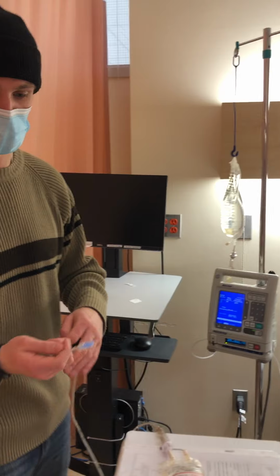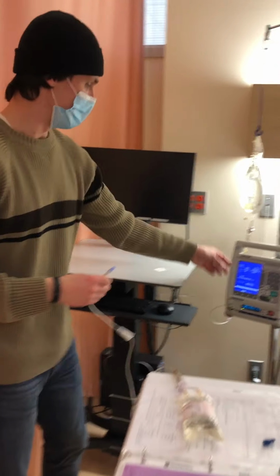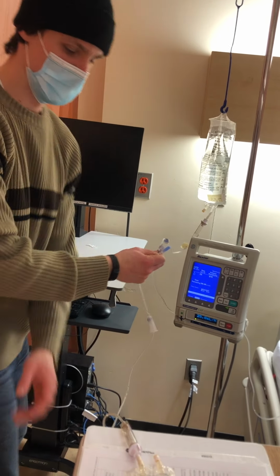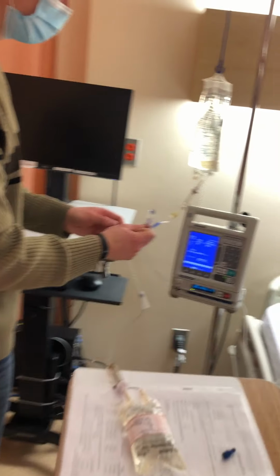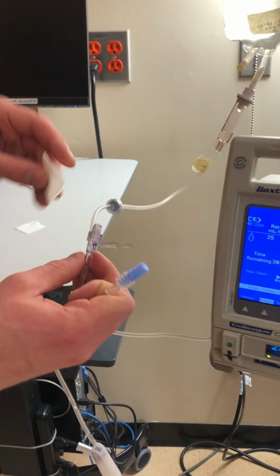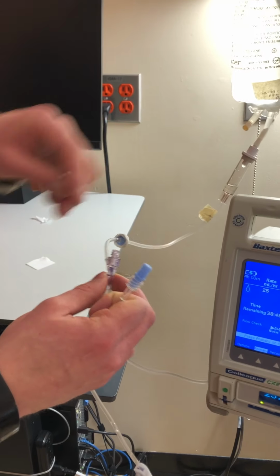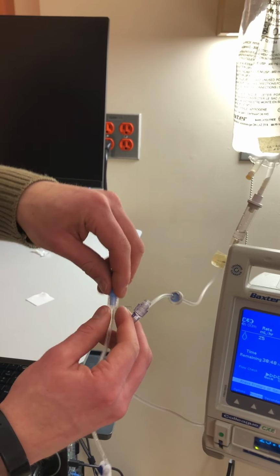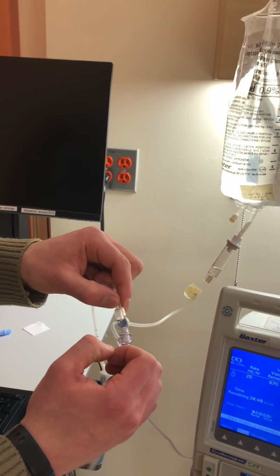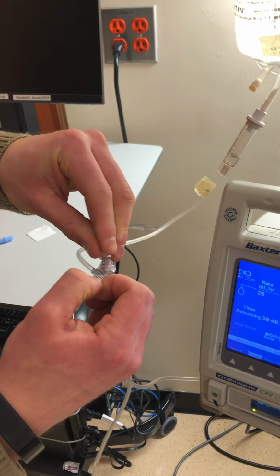And now I can bring this over here. I'm going to be using a port on the IV tubing here that's above the Baxter pump, because it's going to be regulated by the pump here. So I'm going to swab the port here for 30 seconds, let dry for 15, and without contaminating or breaching sterility, I'm going to add this here.